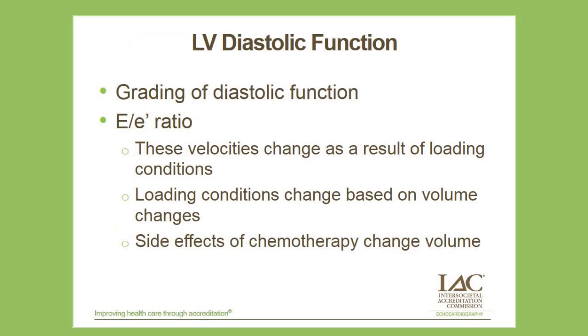Okay, so LV diastolic function is something that we do within our protocol normally, but I just wanted to highlight this a little extra because it's important to grade the diastolic function here. Sometimes we'll see diastolic changes prior to systolic changes on these patients. So the other thing we would want to look at is our E to E prime ratio. And just to caution you with this, remember that these velocities change as a result of loading conditions. And loading conditions change based on volume changes.